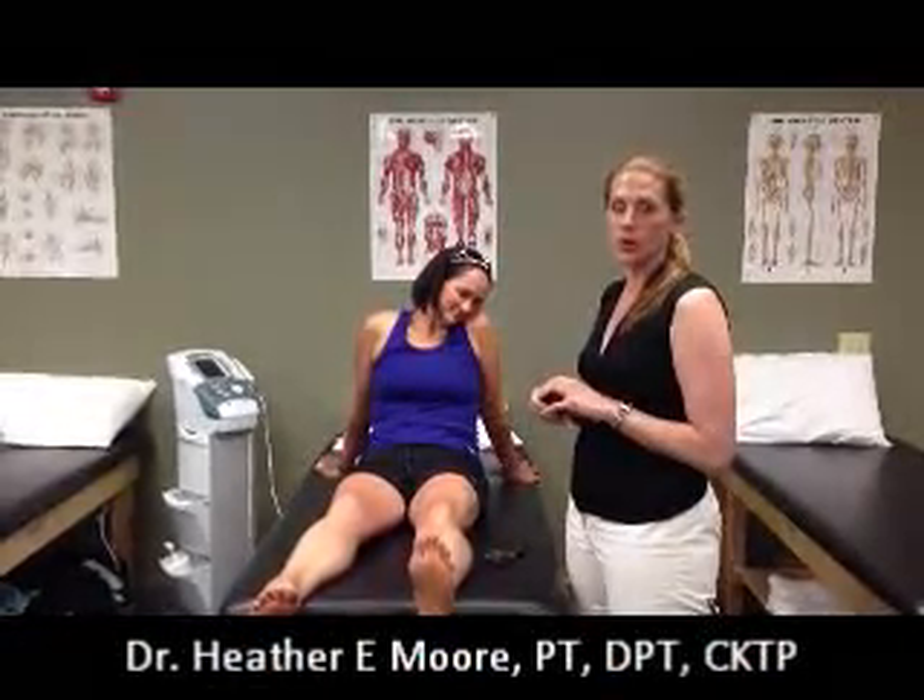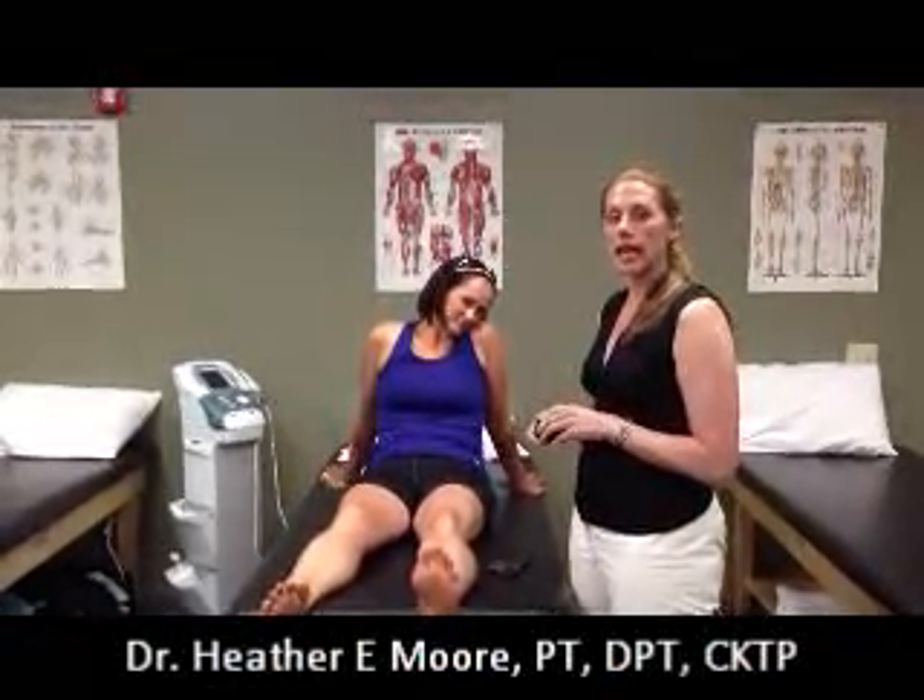Hello, I'm Dr. Heather Moore, owner of Total Performance Physical Therapy. Today we're going to show you how to kinesiology tape an ankle that's swollen and was sprained.